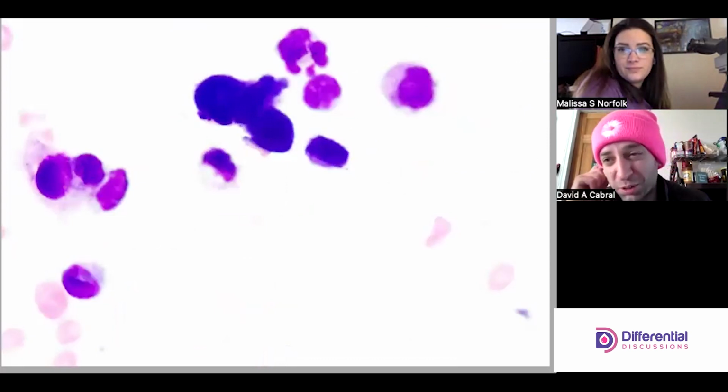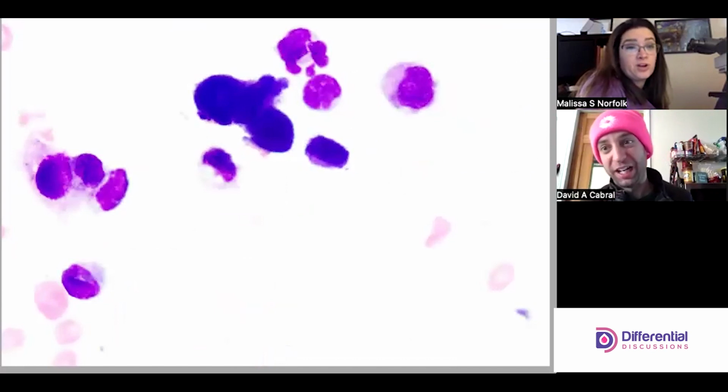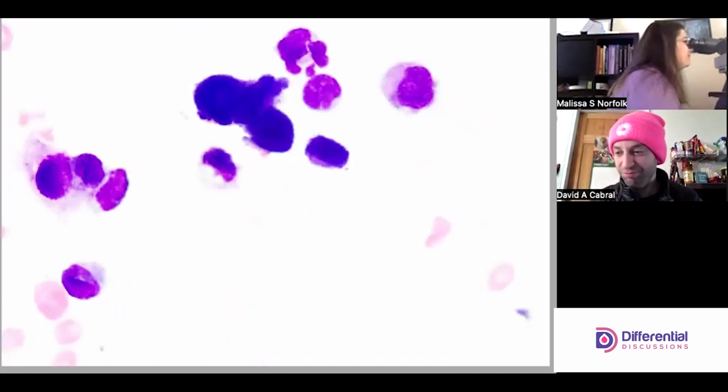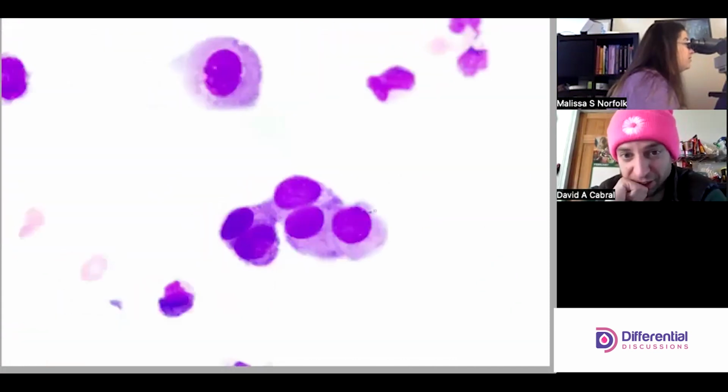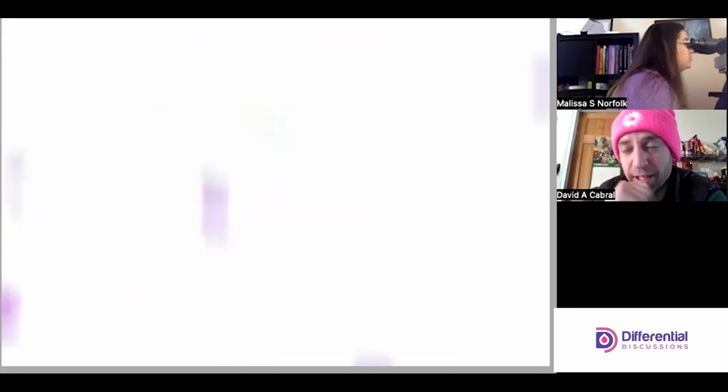Sometimes it's just a circumstance of the junk, and you can't tell what that is. Could be something really bad. There's not a lot of that, but even one or two, it should go for review.